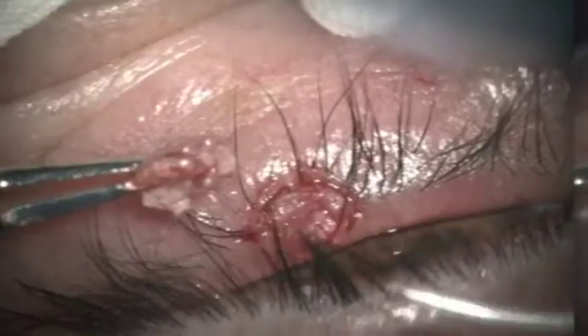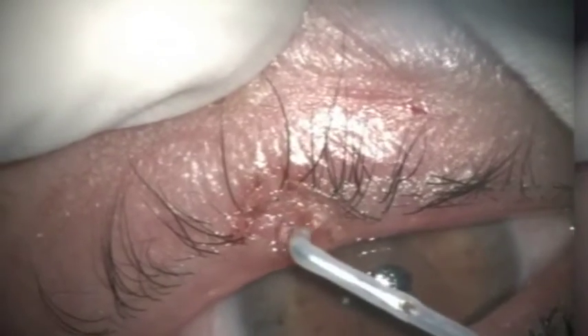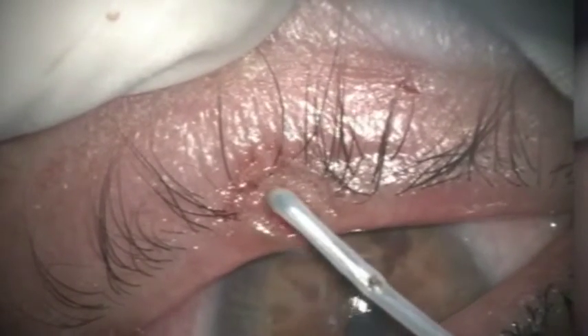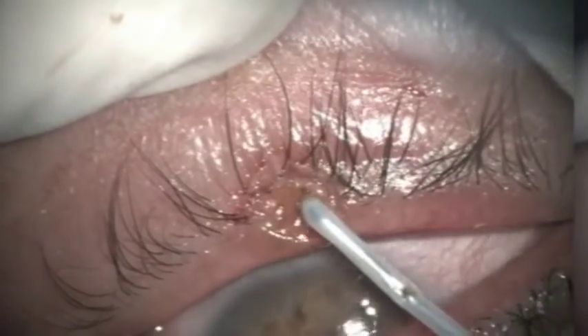The wide base has been cut. You can see a part of the nodule is still there, which I destroy with a 500 micron Fugo blade tip. That is the maximum fineness that I can achieve with the Fugo blade.